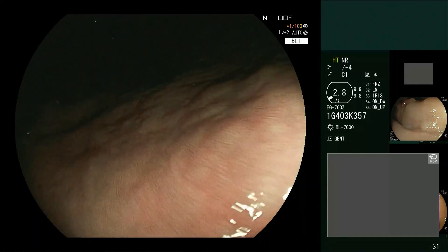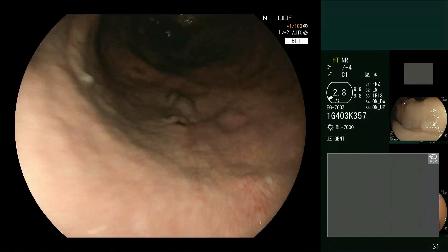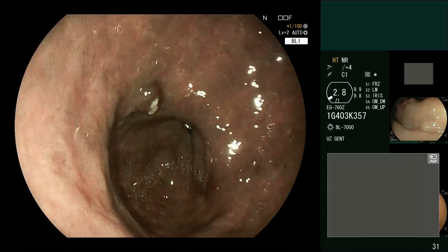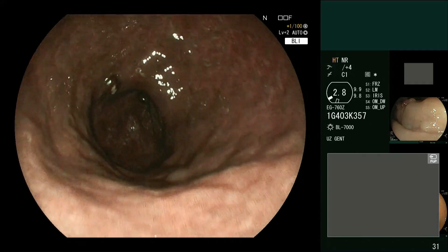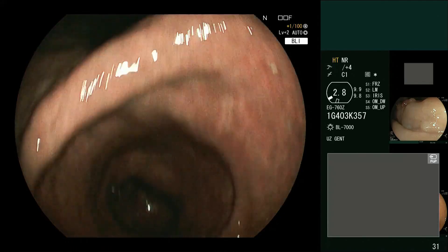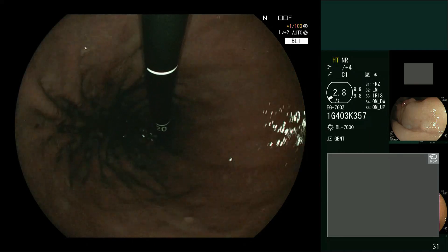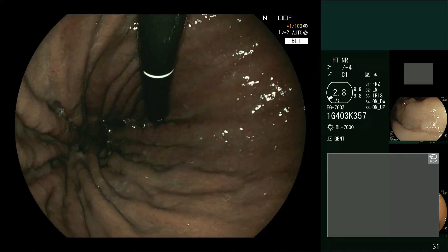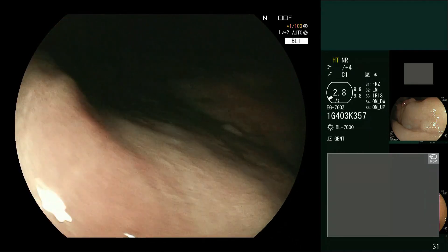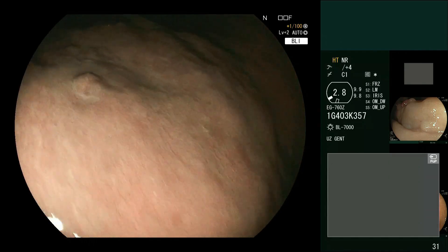If we zoom out a bit — this is BLI overview — the whole stomach is atrophic, with areas of intestinal metaplasia. And if we look up, it's not just the antrum but also the whole of the body and corpus. So this stomach is highly atrophic.